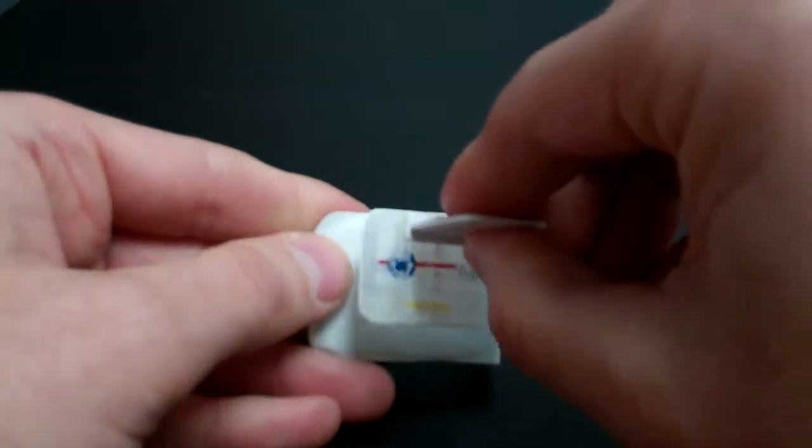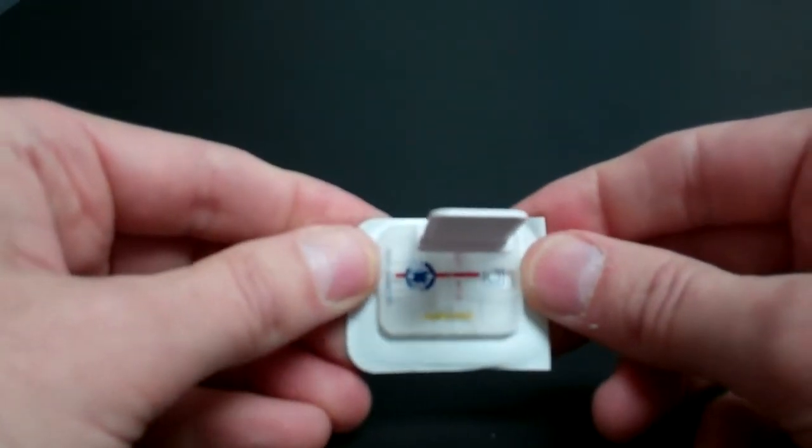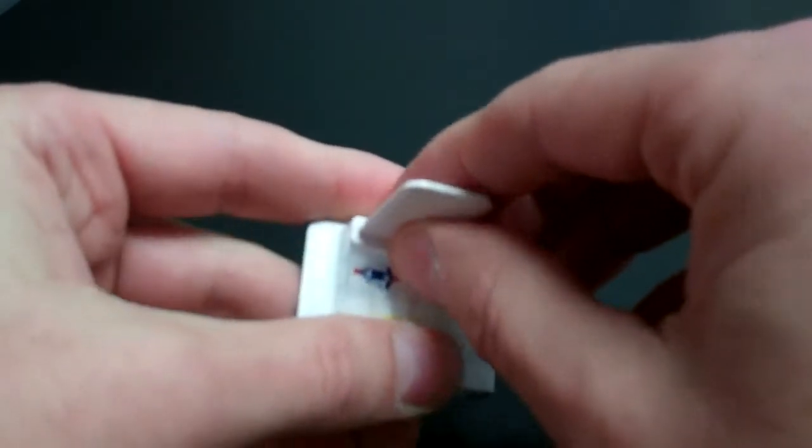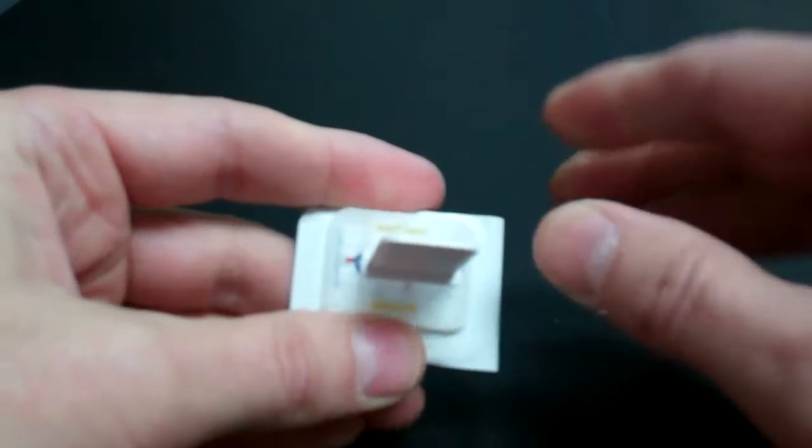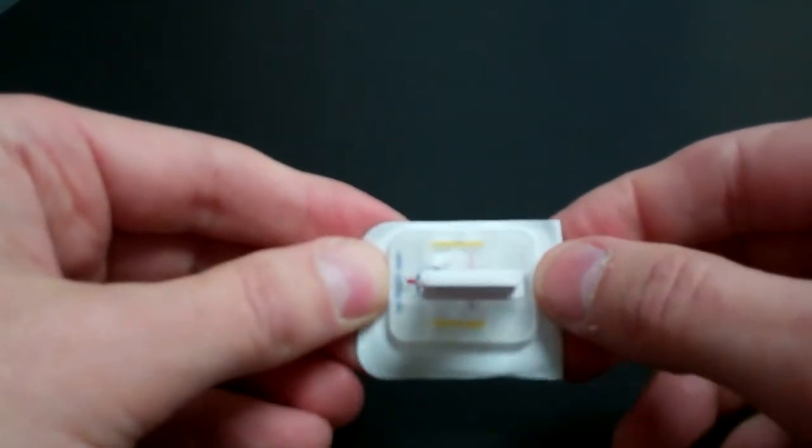So if you wanted to do this particular horizontal periapical indication you would stick it on there, and for a bite wing you would just adjust the tab down into the center and you're ready for a bite wing.